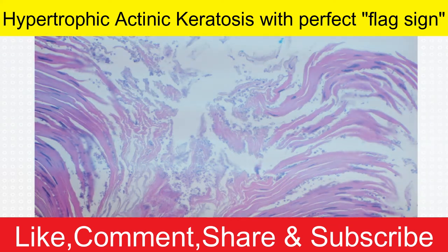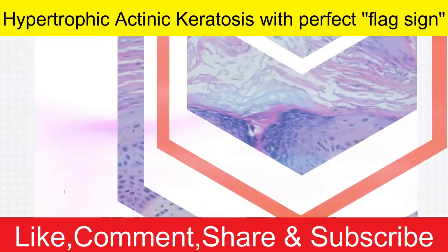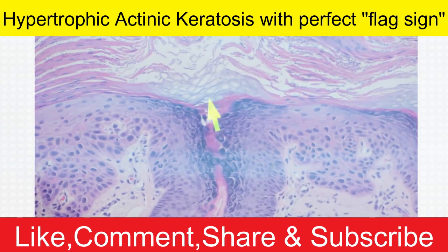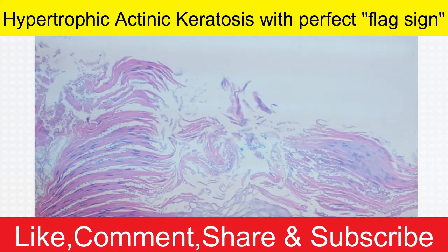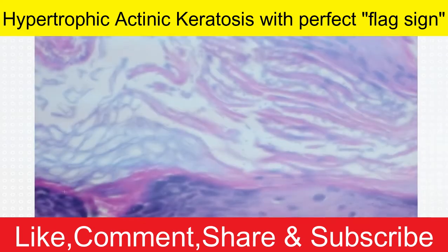And these are Malassezia, also in the past known as Pityrosporum fungus, and they're a type of yeast that lives on basically everyone's skin, and they usually live in the openings of hair follicles because they're living off of the sebaceous secretion. See, here's a sebaceous gland, and they're bubbly because they're full of fat, and that fatty, greasy oil comes out the hair follicle opening to the surface. And normally it gets wiped off your skin, but if you've got a nice thick corneal layer, it can get trapped in there, and then that provides a nice happy home for these fat-loving little yeast to grow and thrive. And you can tell they're yeast because they're round and they're budding.